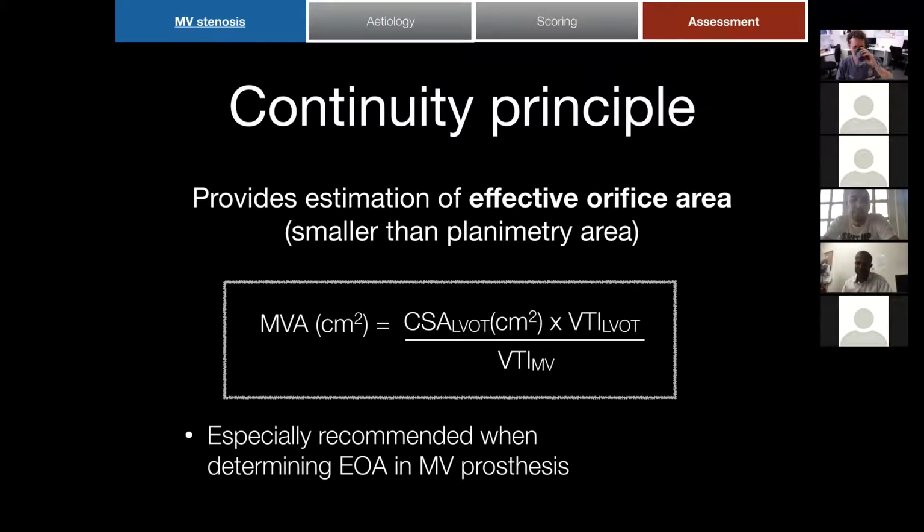So this has the same issues with transmitral flow. And given the multiple measurements required, any error is going to be magnified. So say the VTI measurement is inaccurate, say the LVOT measurement is inaccurate, or the VTI of the mitral valve is inaccurate. The loading conditions are important, and I think we didn't mention the presence of aortic regurgitation as well. Beautiful, and affecting AR.